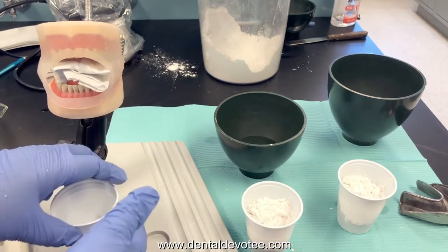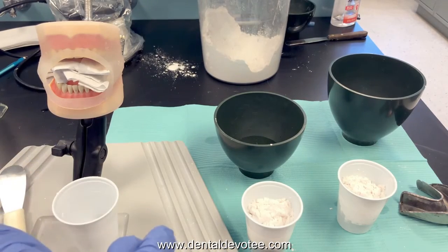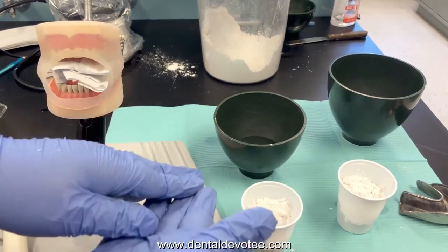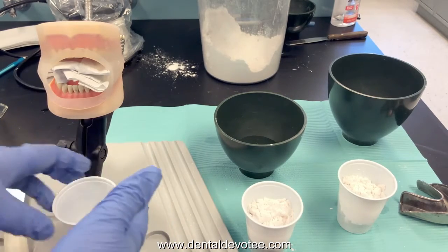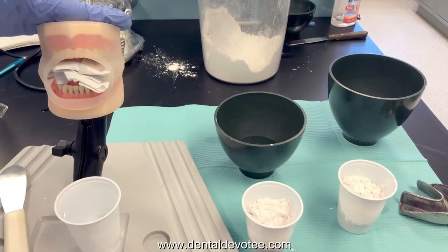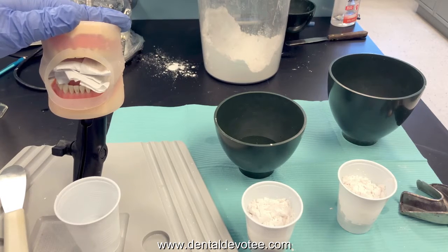Have a cup of water ready because once you load your tray you need to smooth out the surface with some water. When you take out the gauze, take some excess alginate material and wipe it on the occlusal surfaces — that will help reduce voids and give you better anatomy, especially of the occlusal surface. Your patient's teeth should also be clean. If you take an impression of dirty teeth you're going to take an impression of that debris. No plaque, no food particles — start with a clean mouth.